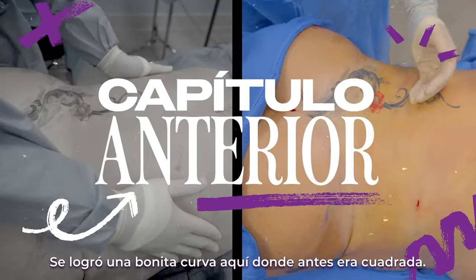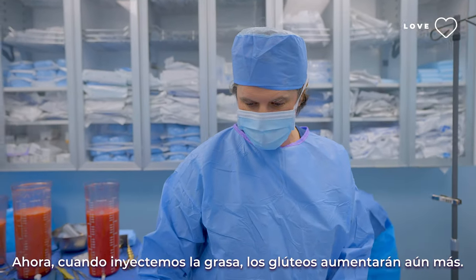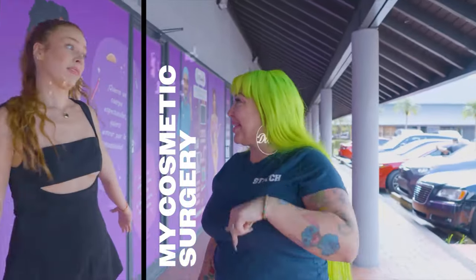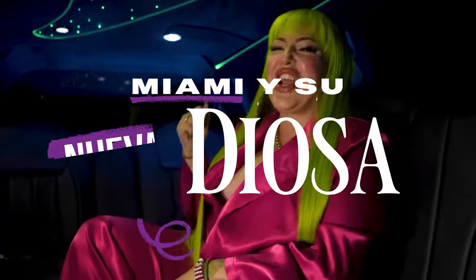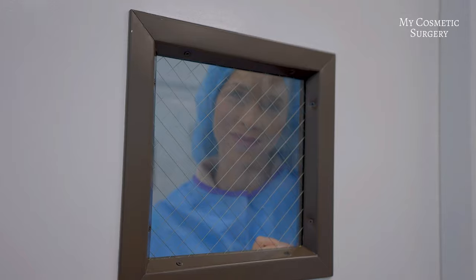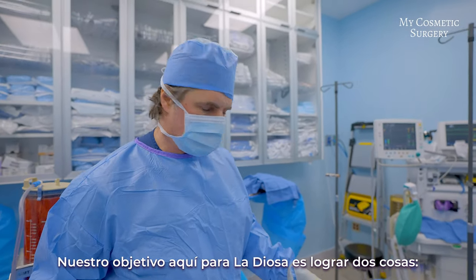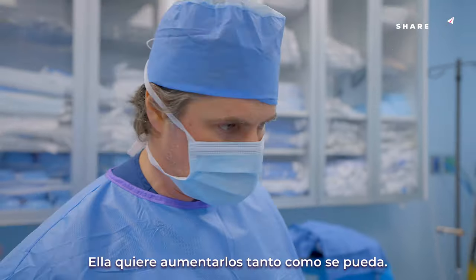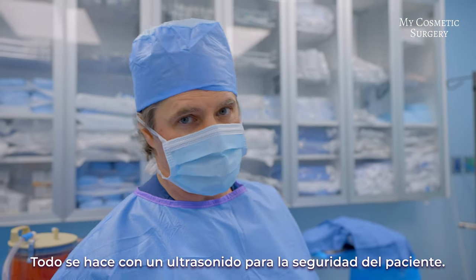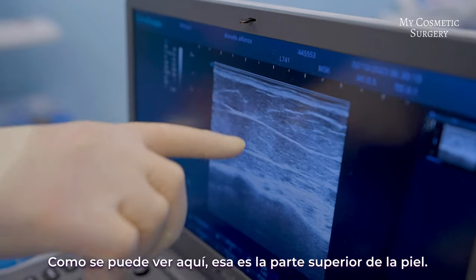Finishing the liposuction on the back — you can see she got a nice curve here; before she was square here. Now when we inject the fat it's going to augment the buttocks even more. Our goal for La Diosa is to accomplish two things: she wants more hips and she wants more volume in her buttocks, and she wants to go as large as we can. Everything is done with an ultrasound — that's for patient safety.